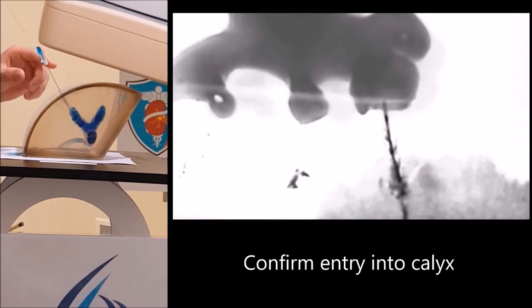Confirm entry into the calyx by identifying urine draining from the needle.